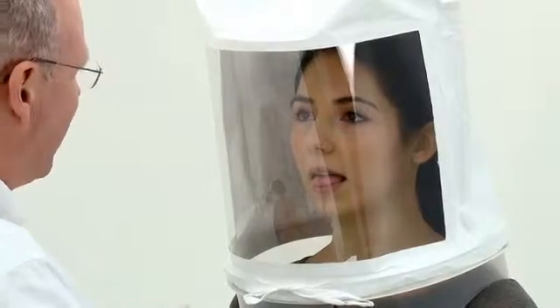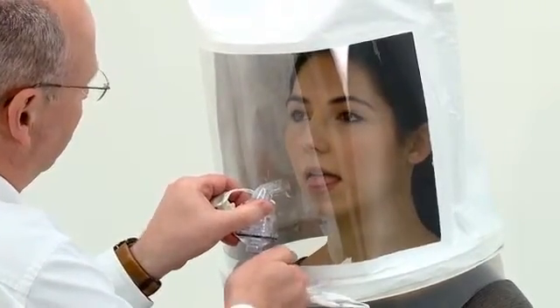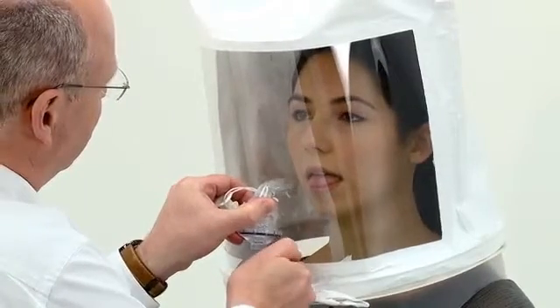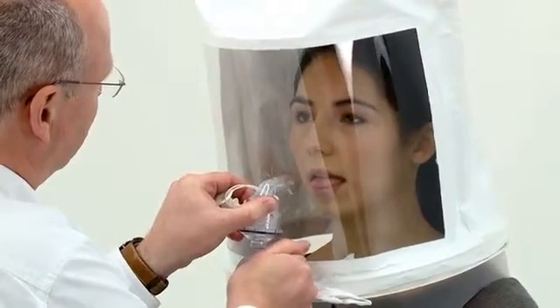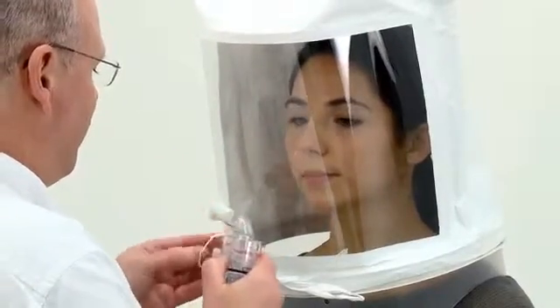Place the sensitivity test nebuliser into the hole in the front of the hood, squeeze the bulb to inject the test solution, allow the bulb to inflate fully between squeezes, and count and take a note of the number of squeezes it takes for the wearer to taste the solution.